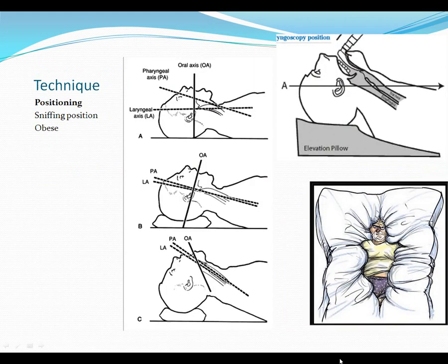All right, probably seen this. So this is the classic sniffing position. The reason for doing this sniffing position is to align these 3 axes and optimize your view through the mouth to see the chords.